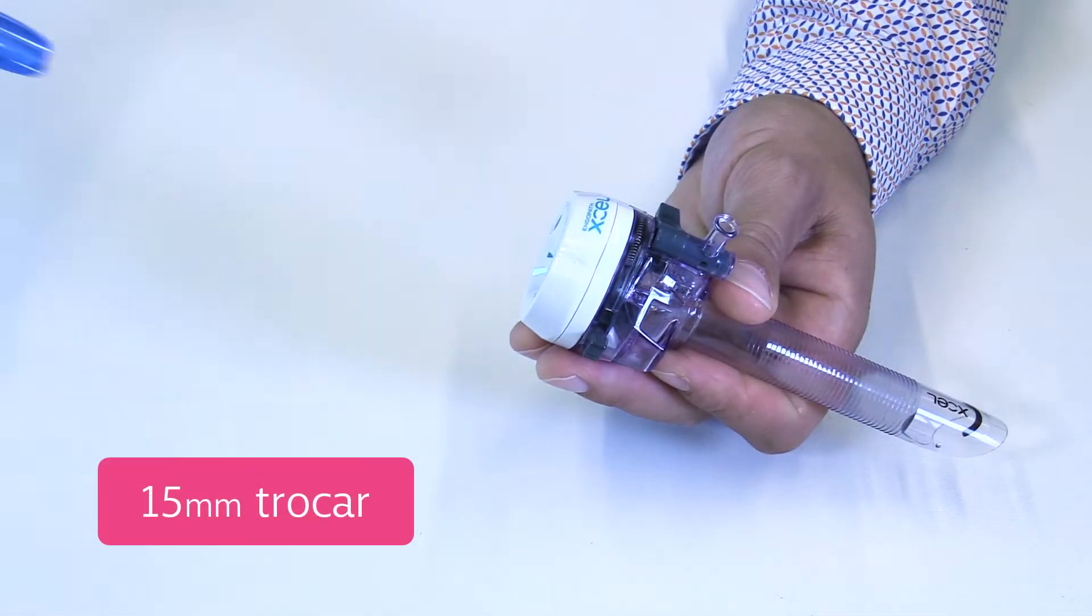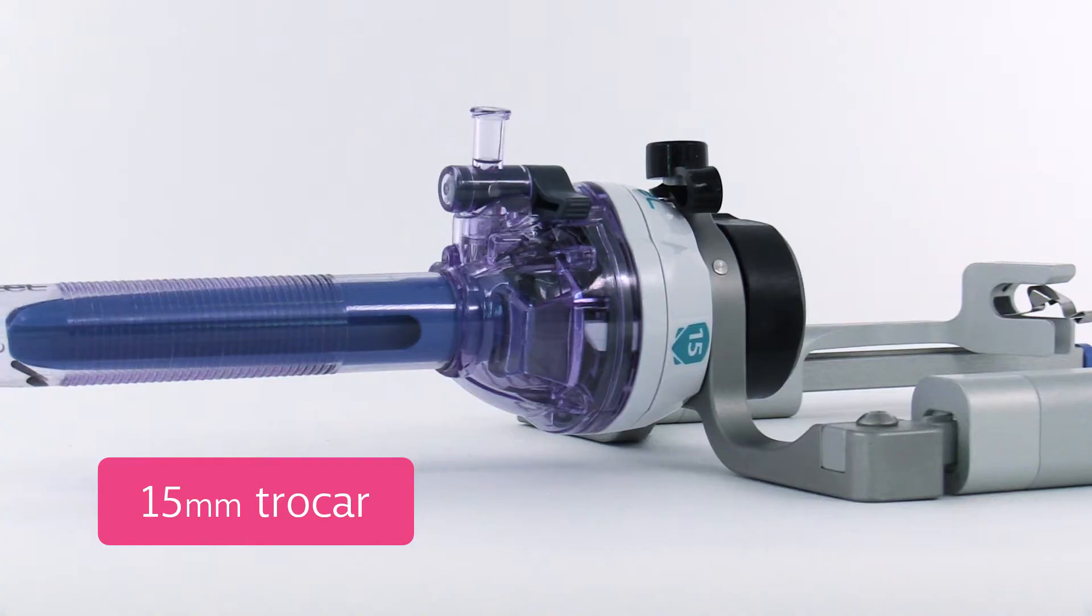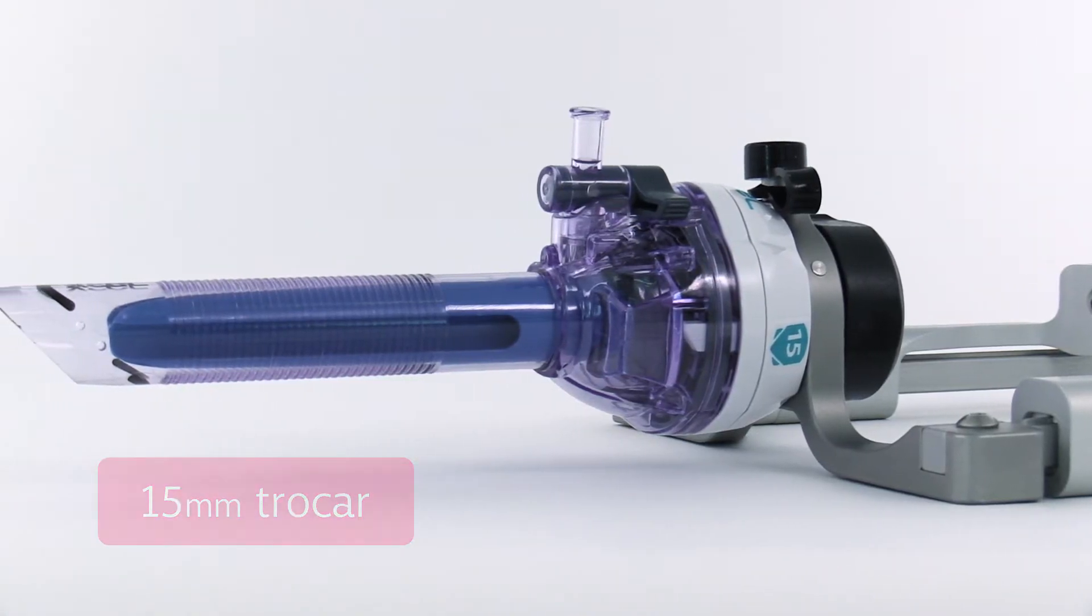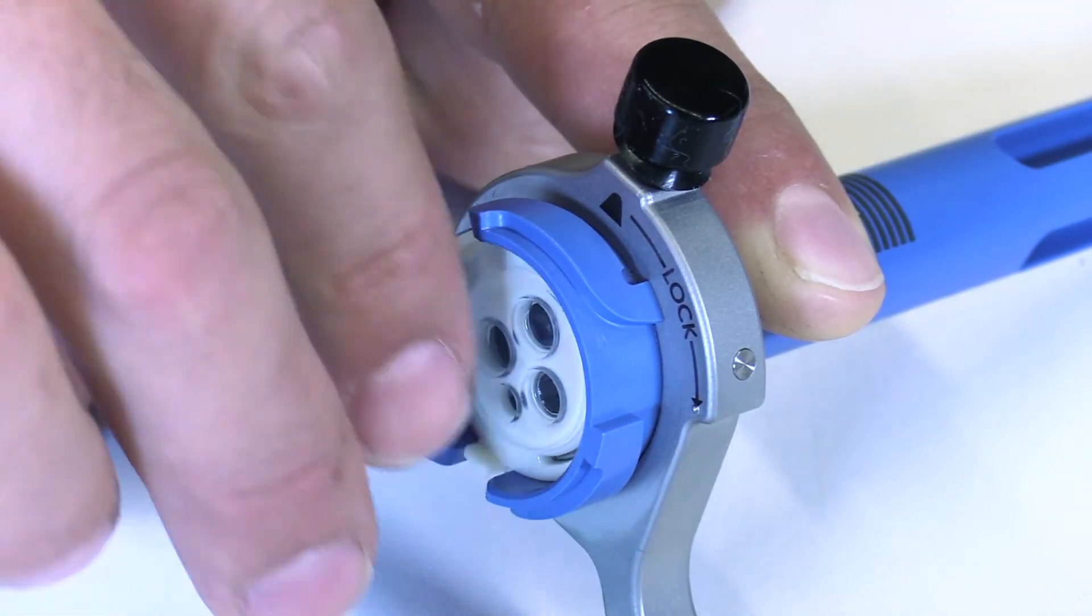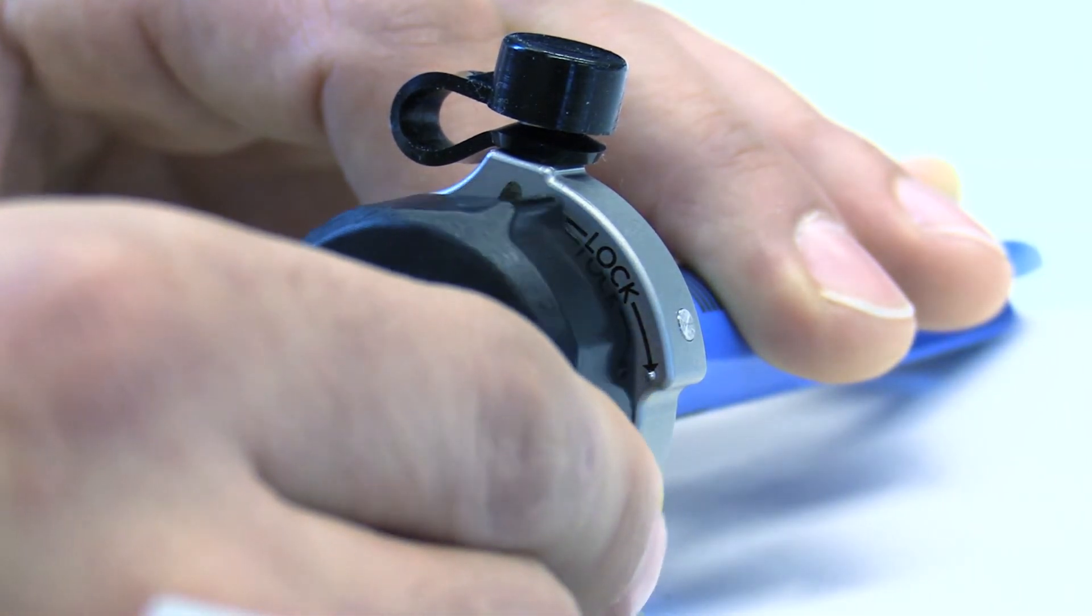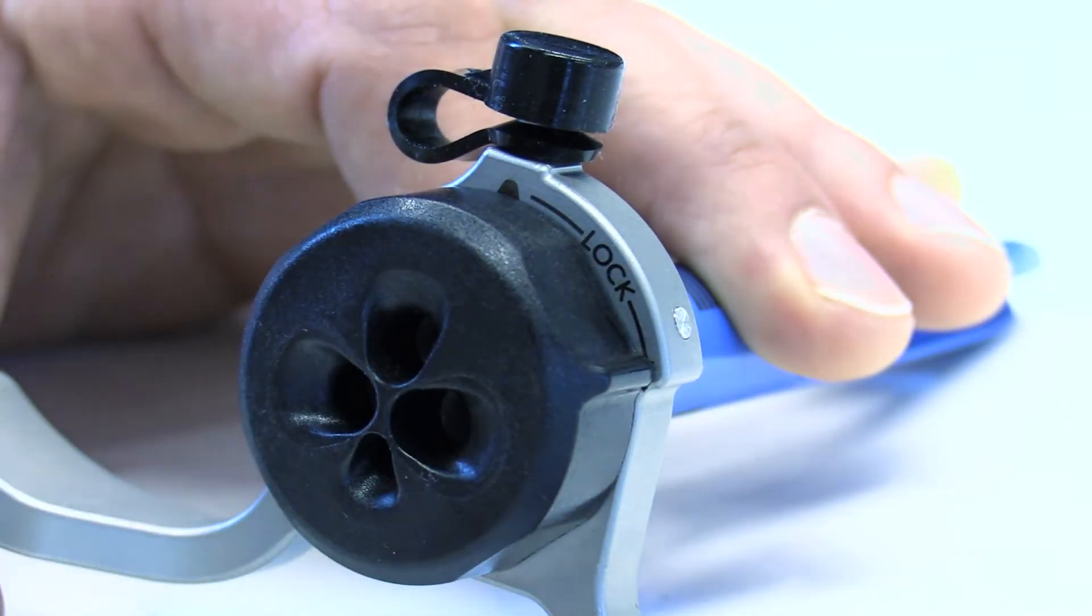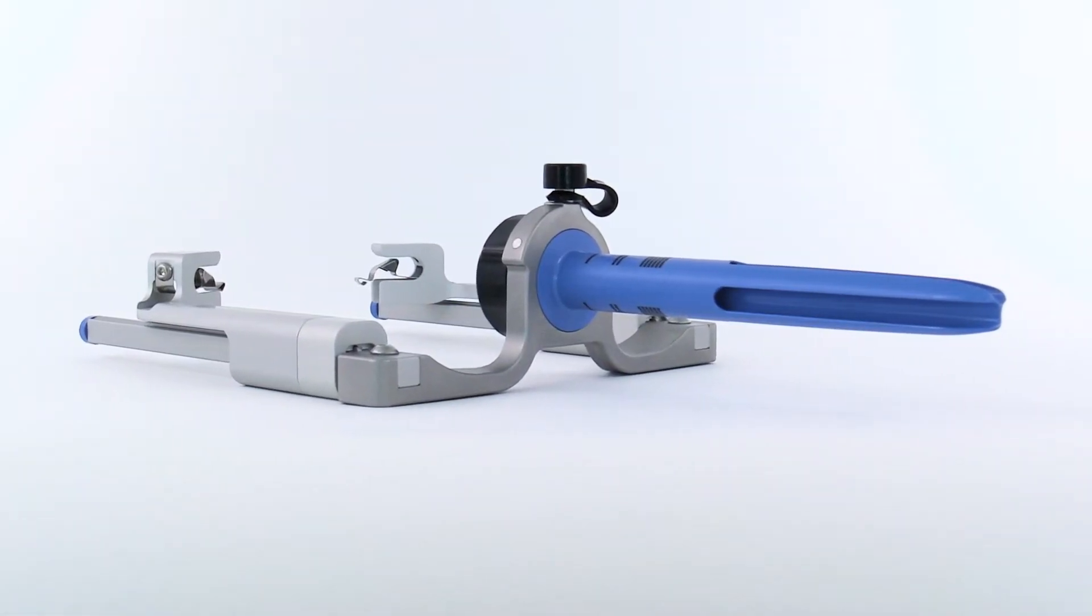The introducer is inserted through a 15 millimeter trocar in the umbilicus in free-floating mode. To maintain pneumoperitoneum throughout the procedure, a disposable sealing unit is loaded and locked into position with a cap. The introducer is reusable and can be easily cleaned, sterilized, and maintained.